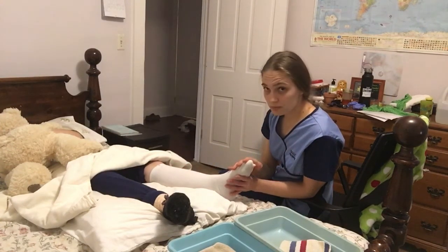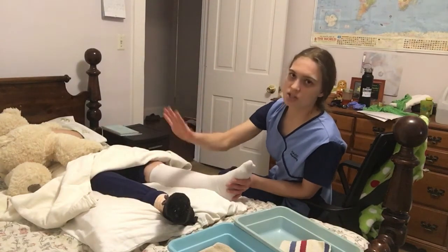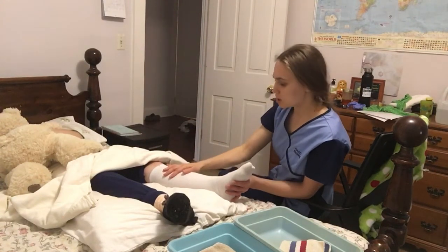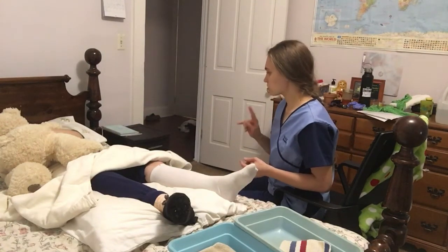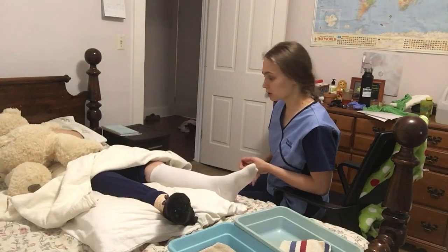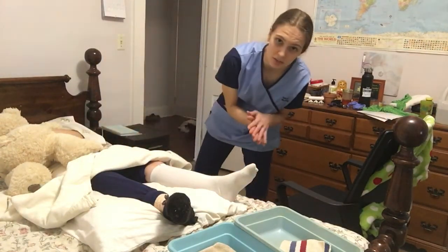And now I am finished applying the TED stocking to one leg. I'll do the washing and everything to the other leg as well, but for the sake of this video, I've only done one. Before I leave the room, I'm going to make sure all my supplies are put away, that the bed is at the lowest level, that the bed rails are raised if care planned accordingly, that my patient has their call bell, and I'm going to wash my hands before I leave the room.